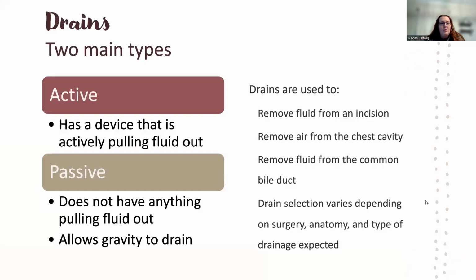So we're going to talk about a lot of different types of both drains and catheters. They are sometimes hard to keep straight, so come back and reference this if you need to, or before you take your certification exam. They like to ask questions about drains and catheters for sure on that exam, okay?